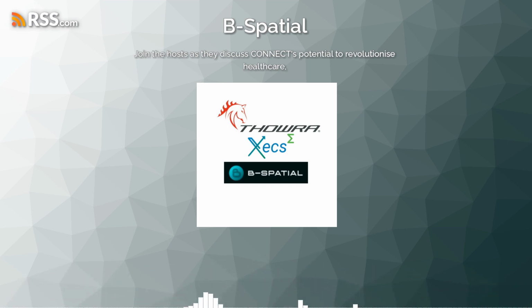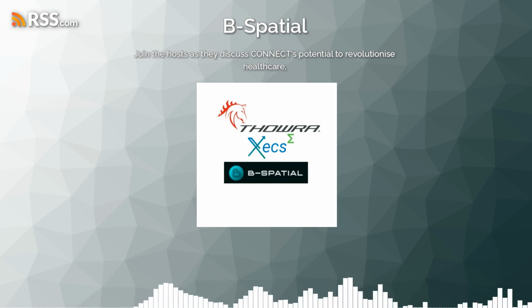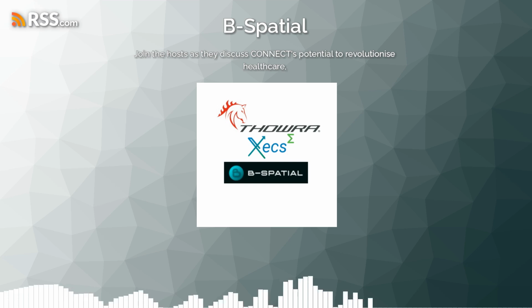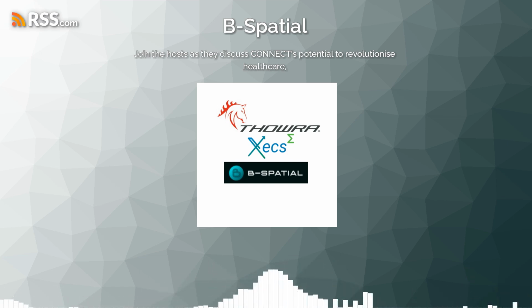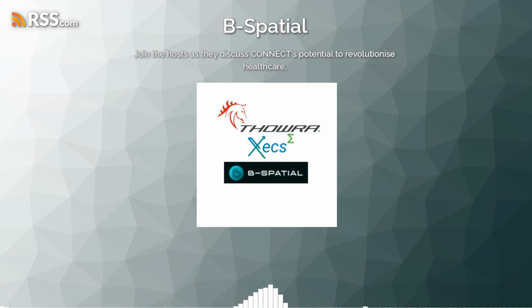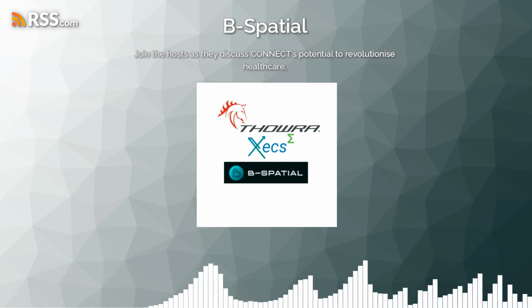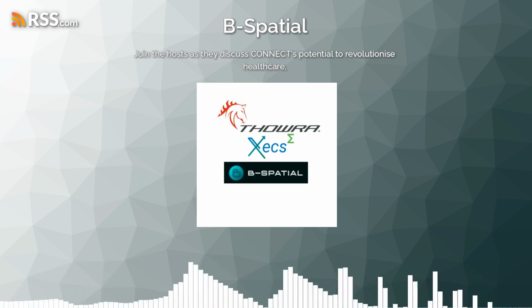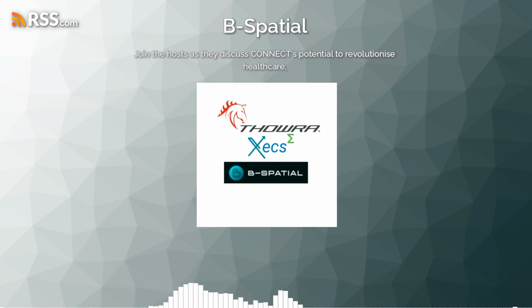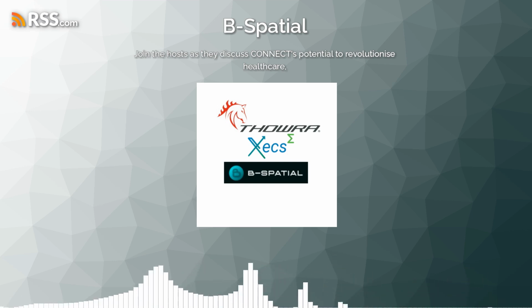Well, CONNECT stands for Cognitive and Neurological Network EEG Cloud Technology. Whoa, that's a mouthful. Yeah, it is. But basically, it's all about changing how we monitor brain activity, especially for people with epilepsy. So think like those epilepsy monitoring units you see in hospitals. Kind of. But instead of those big clunky machines, CONNECT uses something called low-channel EEG. It's like a simpler, more accessible version that can be used anywhere.